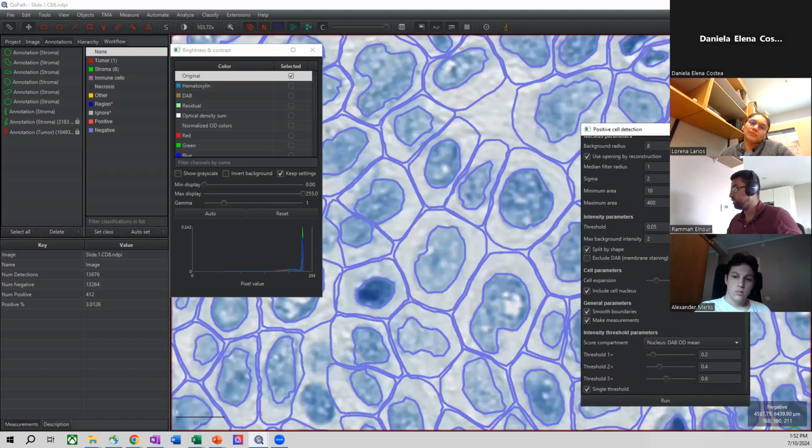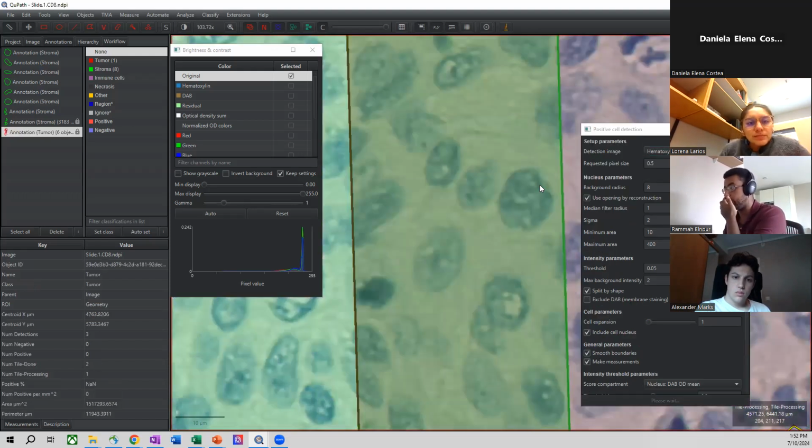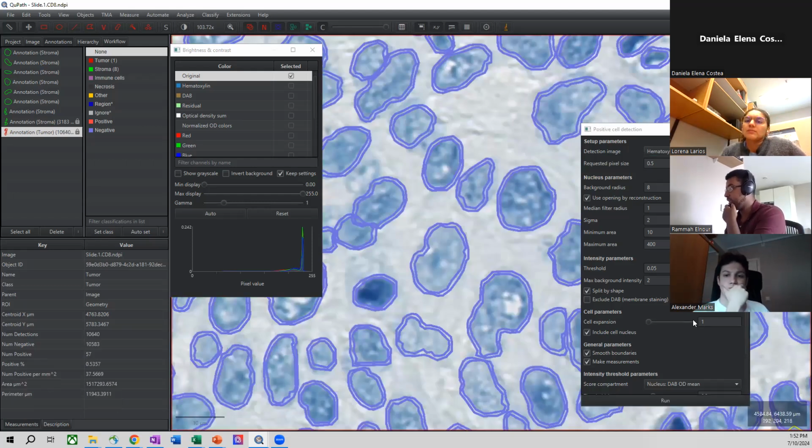So I can potentially change this to, let's say, 1 and 1 again. And you see that this radius should decrease, should become smaller, something like that. And you could increase it to 5.